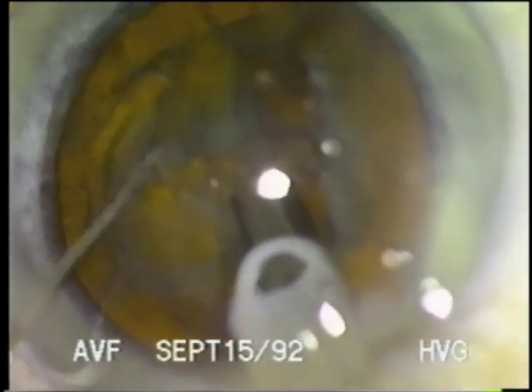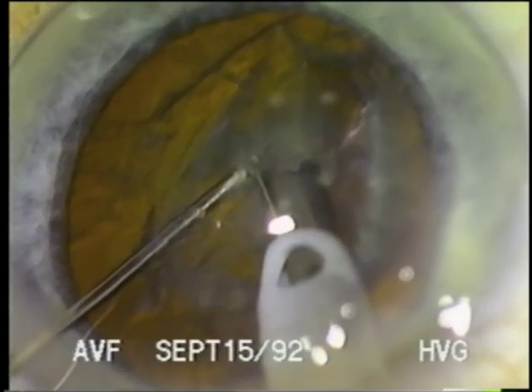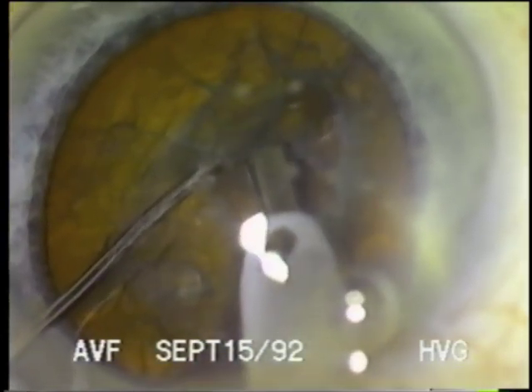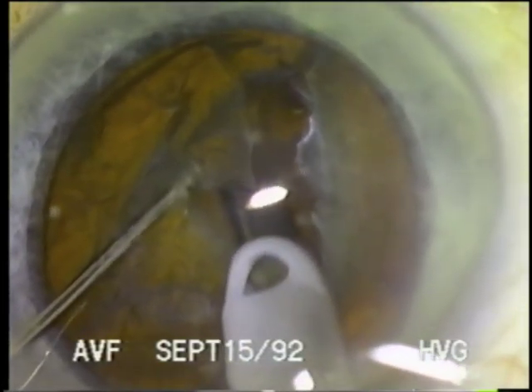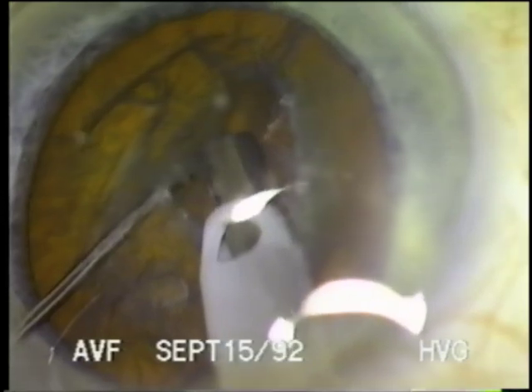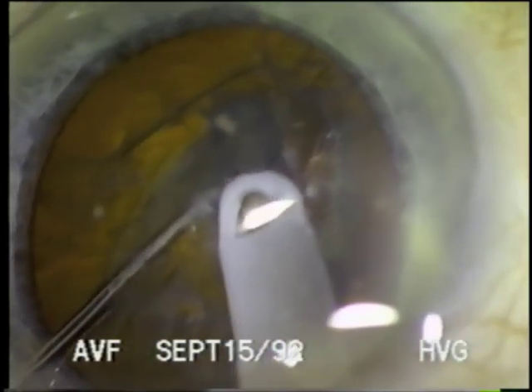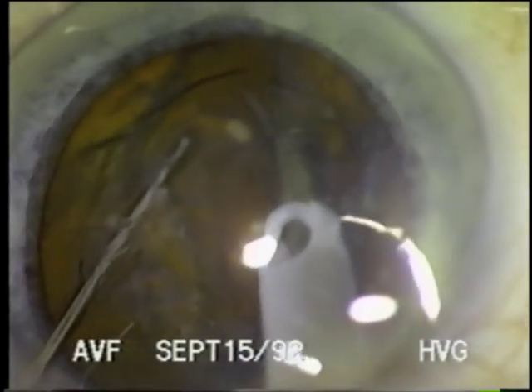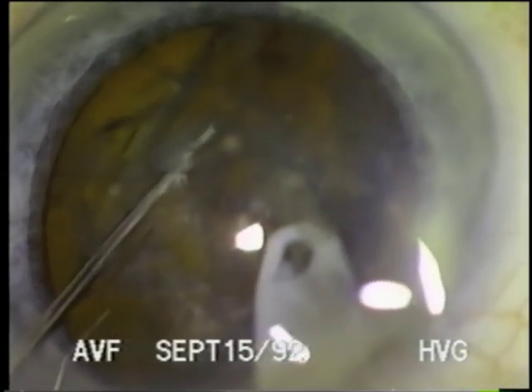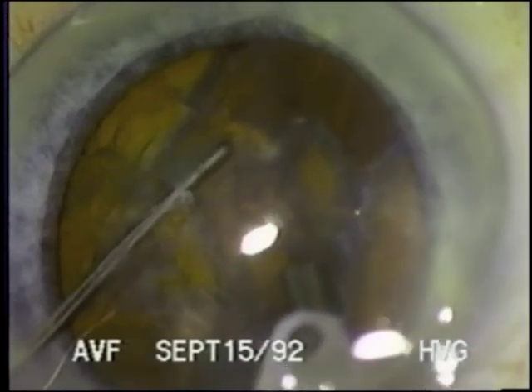This fracture should extend through the nucleus and epinucleus from the 6 o'clock to 12 o'clock position as illustrated here. Note that the right hemisection is pushed away freely by the spatula, indicating a complete fracture. The lens is rotated slightly clockwise, and the phaco tip then buries into this hemisection, and while maintaining irrigation aspiration, a segment is broken off. While the spatula is holding back the rest of the lens, this segment is then emulsified.